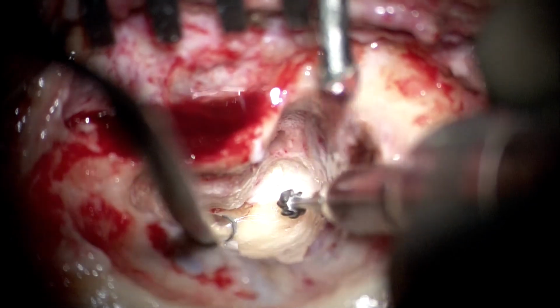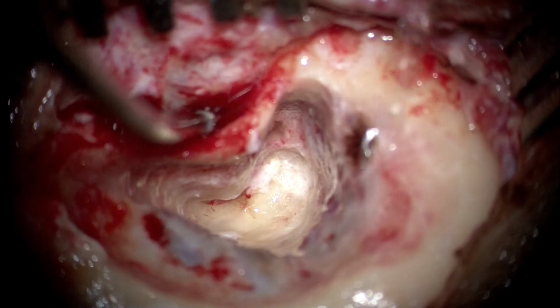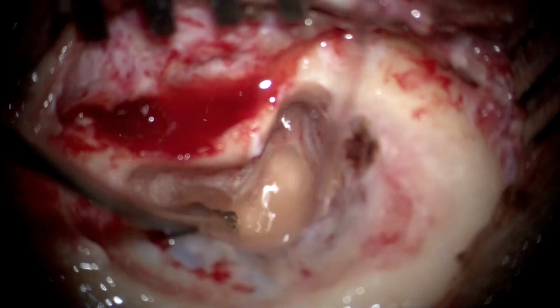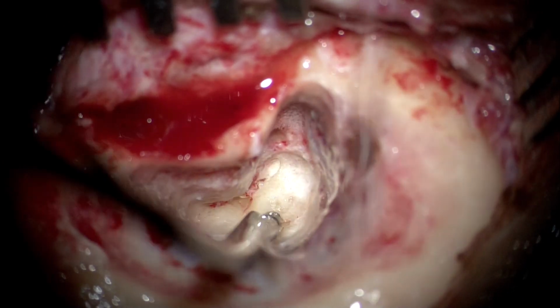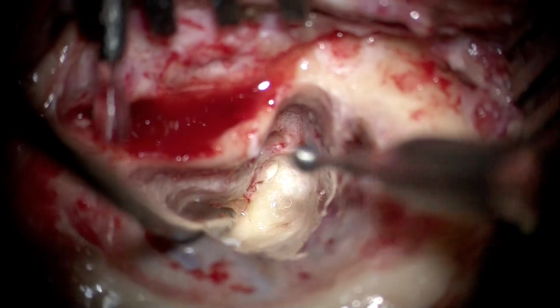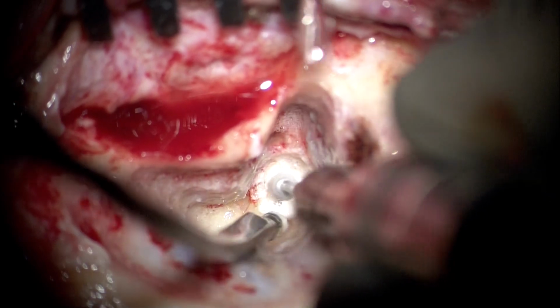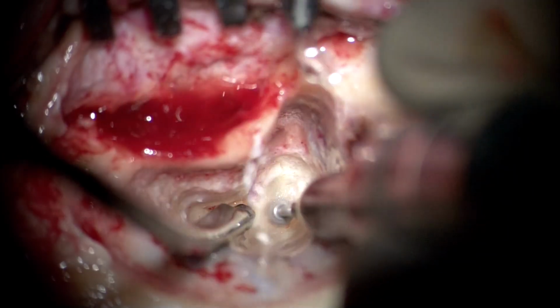You can see now the labyrinth is open. The vestibule is now open, and all the canals are drilled. But still we are unable to get a very good trajectory of vision inside the vestibule. The sensory neuroepithelium can now be seen inside the superior vestibule.